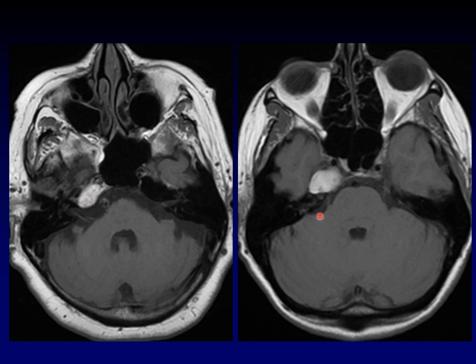On this patient, this is an expansile object. Look how it remodels the contour of the petrous apex. It's also bright on T1, and that's characteristic of a cholesterol granuloma, but we can use other sequences to confirm our suspicions.